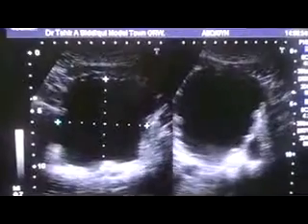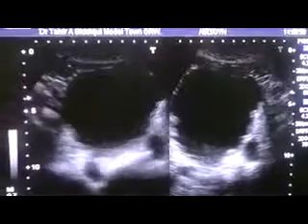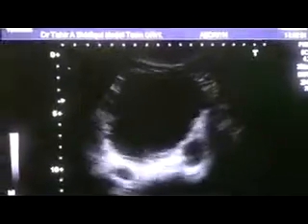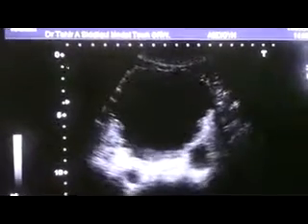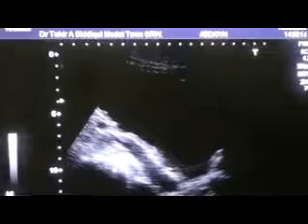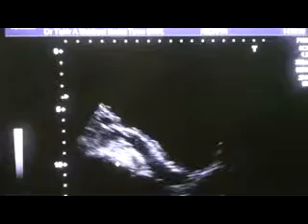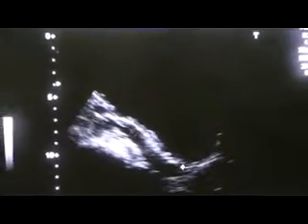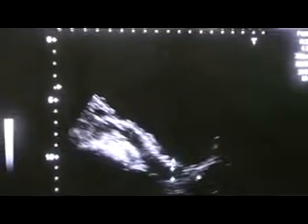Much raised. Now these eye-shaped structures that you are seeing, this is the dilated left distal ureter in transverse section, this is the dilated right distal ureter in transverse section. Let's study first the right side, and here we go. This length is representative of the longitudinal section of the dilated right ureter up to its entrance into the urinary bladder.